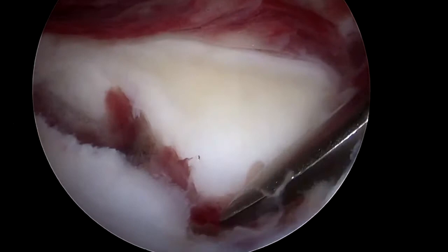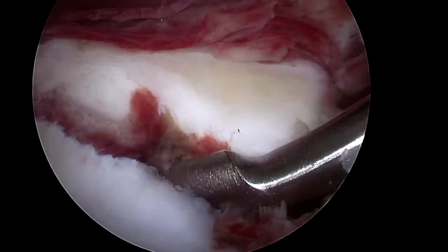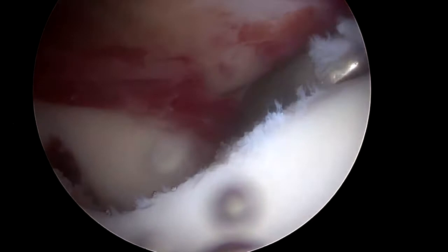Through an antero-superior portal, an angled elevator is introduced to mobilize the fragment. Anatomical reduction is then tested with an arthroscopic grasper.